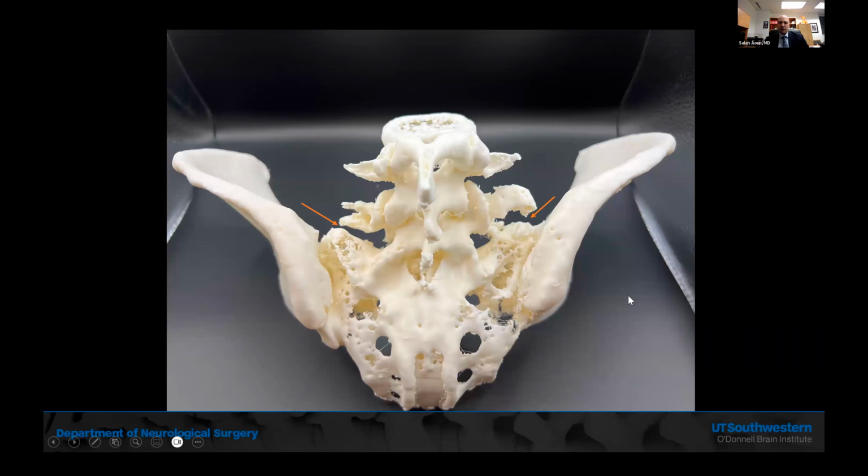She was very happy after that was done, and I think having the model in the room really helped us be confident with the degree of her resection. Otherwise, surgeons tend to stop when they feel like it's becoming risky. This was very deep into her back, so without the model, we probably would have stopped earlier and maybe left more residual.